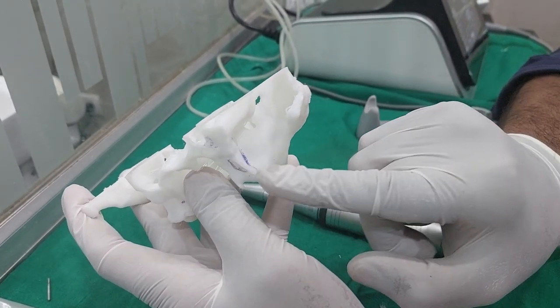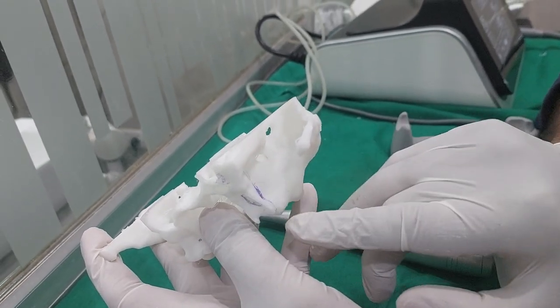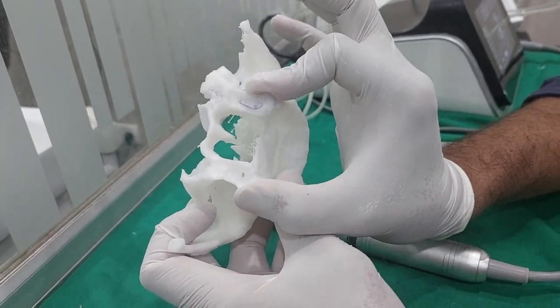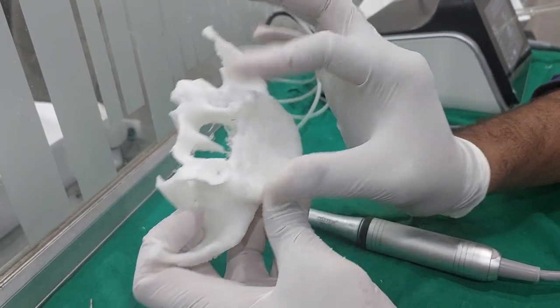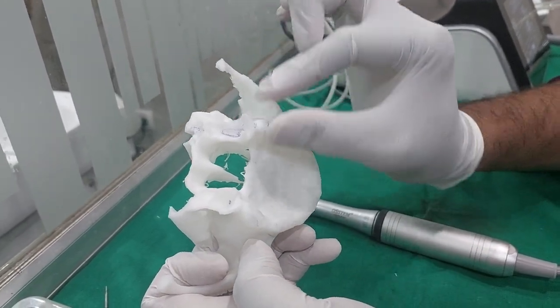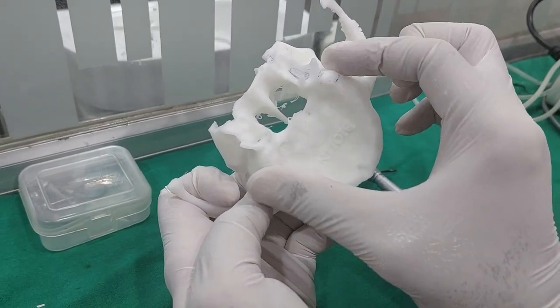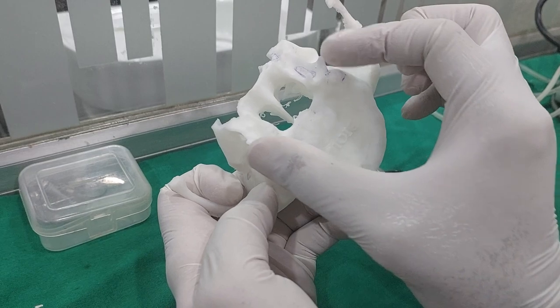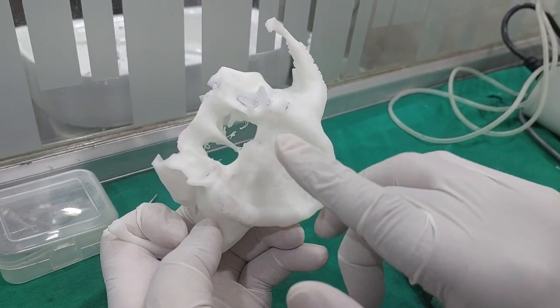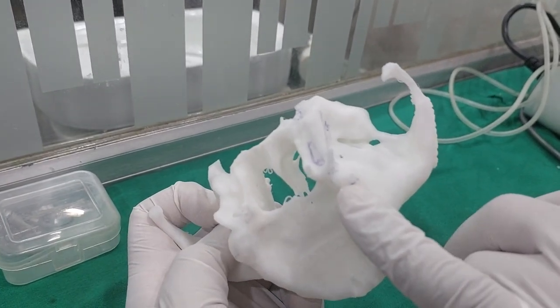The pterygomaxillary fissure is on average 30 to 35 mm away from the tuberosity, because in between there is a fusion zone. The inter-pterygoid distance remains constant in every patient. However, the alveolar process gets resorbed - in a young patient, the alveolar process is more prominent, but as resorption happens with aging, that alveolar process recedes. So the pterygoid region remains constant, but the alveolar process changes. Accordingly, with patient age and resorption, the direction and point of entry of the pterygoid implant changes.